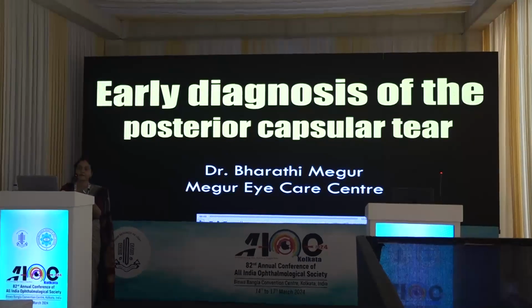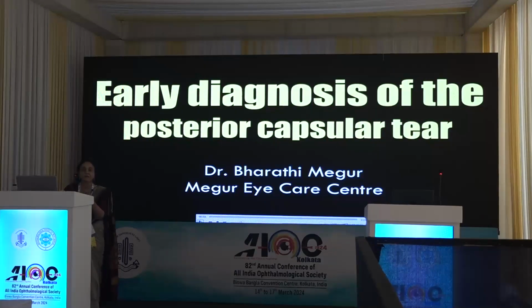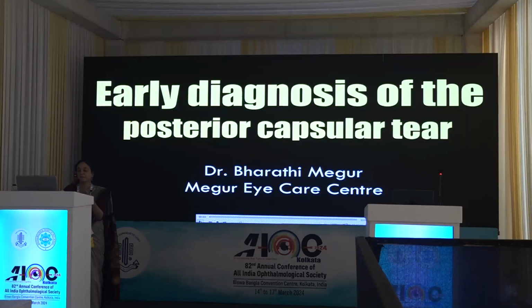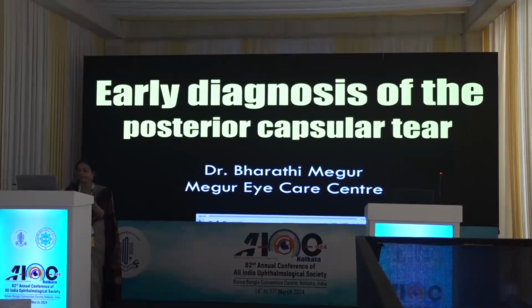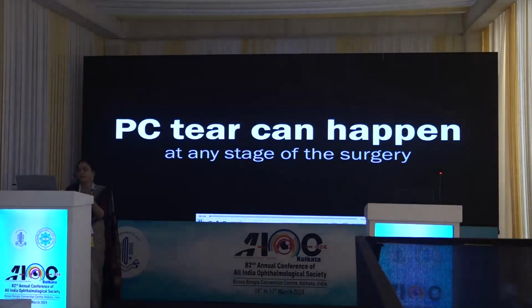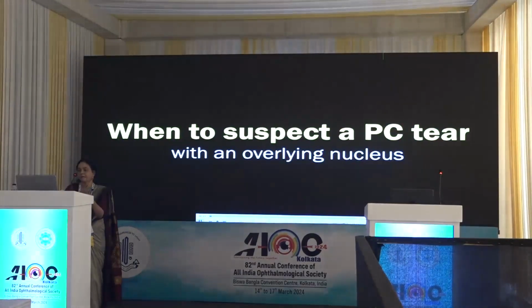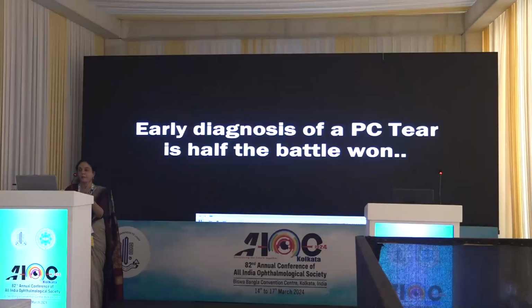Diagnosis of the posterior capsular tear. Inevitably, as cataract surgeons, all of us are bound to experience posterior capsular tear, and let me share with you some of the tips on how to diagnose it early. It can happen during any stage of cataract surgery. So, when to suspect a PC tear with an overlying nucleus?